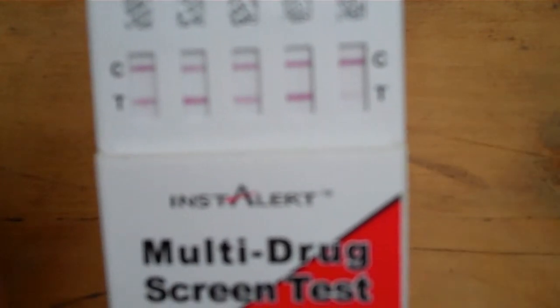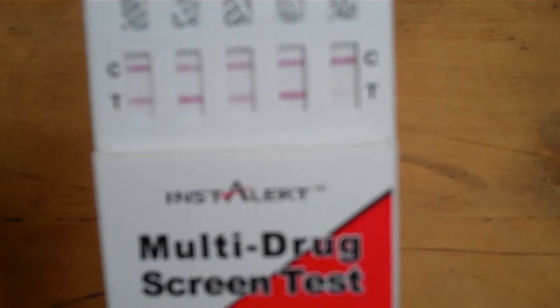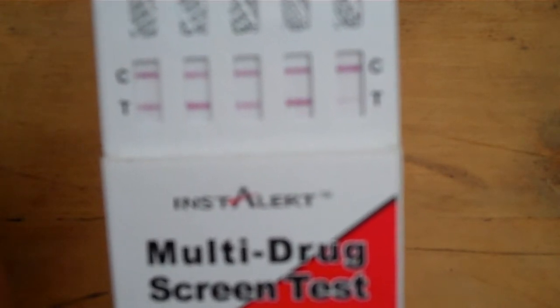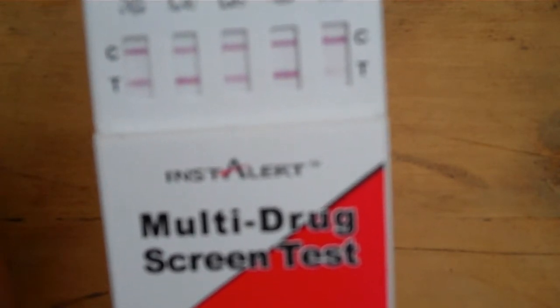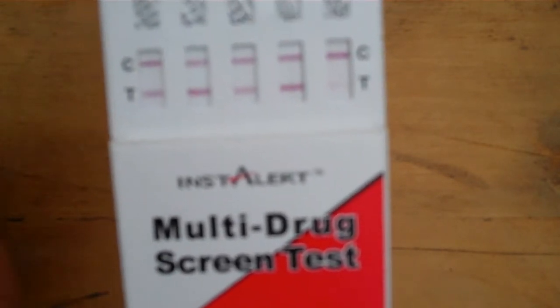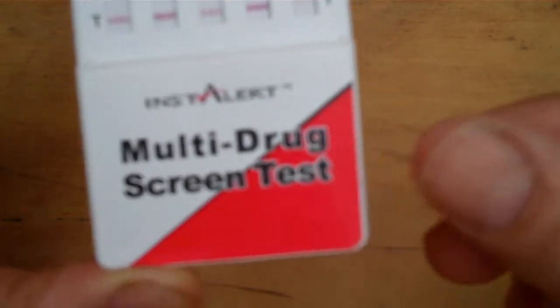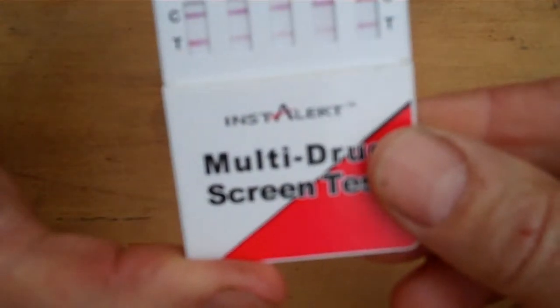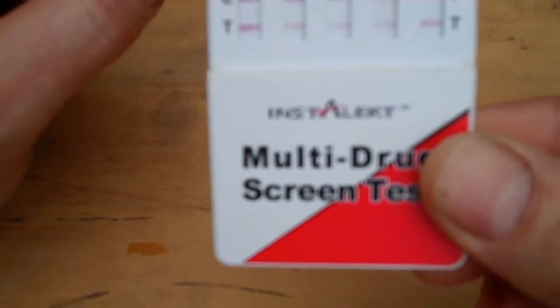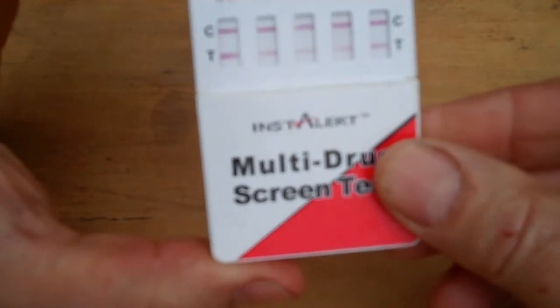I've got a faint test line showing at 1 to 2 minutes, so I'm interpreting that as a clear negative test result for TCA. Even though it's much fainter, thinner, and not as colour dense as the BZO, you must not try and draw any inference by that. It is a negative test result. So at that stage, after 1.5 to 2 minutes, if you've got all negative results on your panel, that's it. Your test's complete. You can move on to the next test that you have to perform.